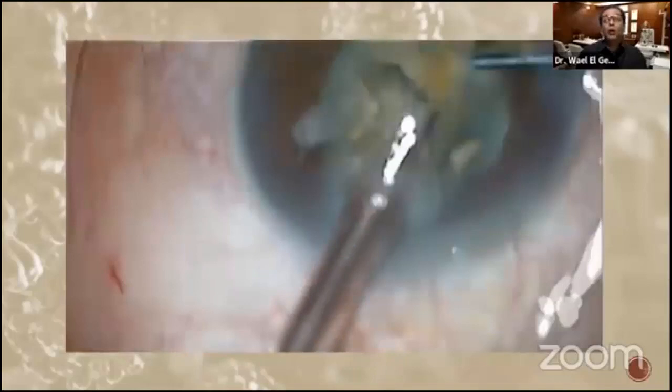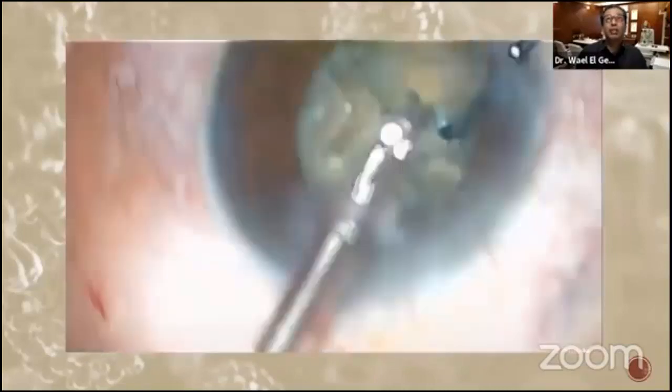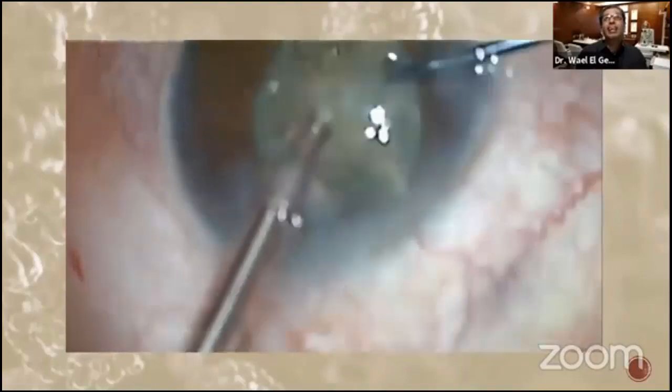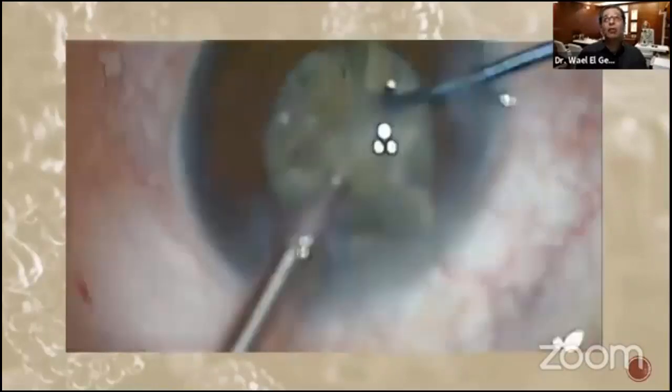And now, when I'm emulsifying quadrants, I make sure that I chop each quadrant. I'm a little bit out of view here, but I will come back to the view in a second. I don't emulsify large particles. I keep chopping all the time.